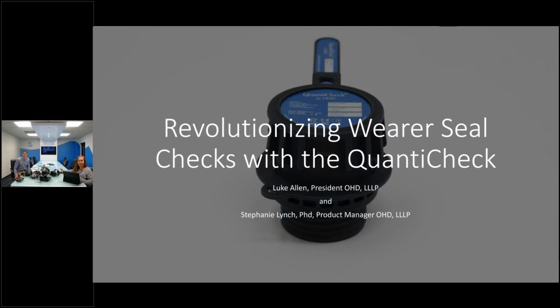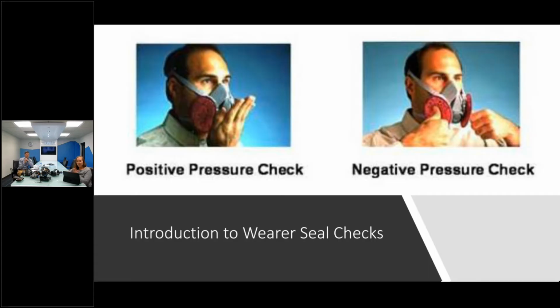If you've worked at all with respirators, then you're likely pretty familiar with a traditional wearer seal check. It's up on the screen now, the two different versions. And like Luke said, this shouldn't be confused with a fit test. It's not providing the same assurance of fit, but it's supposed to help you assess your seal every time you don that respirator.